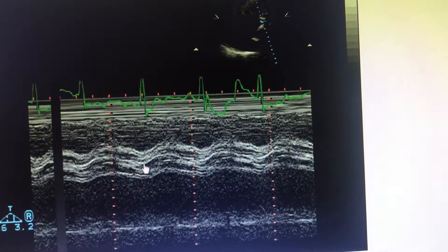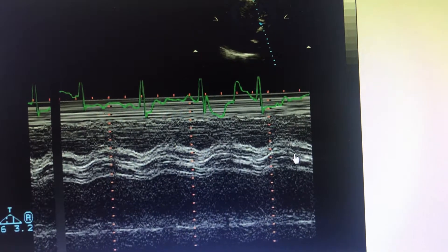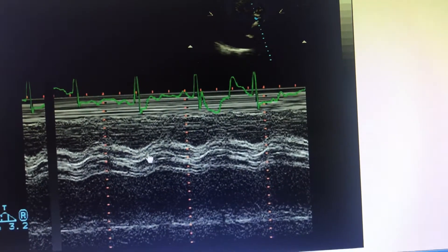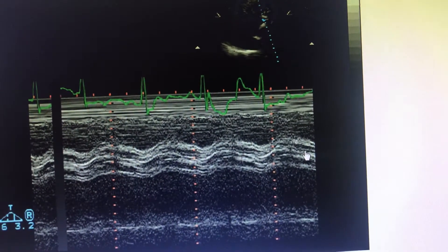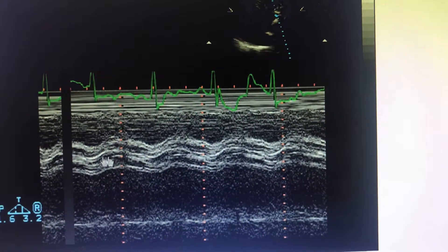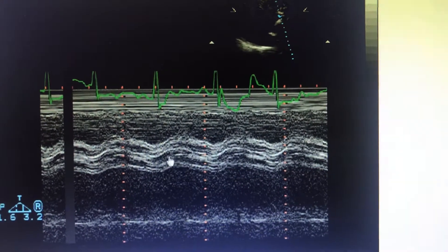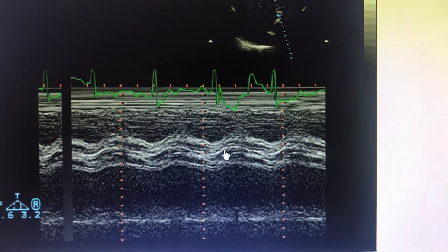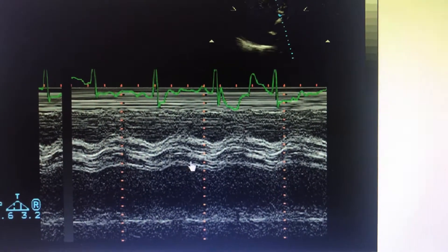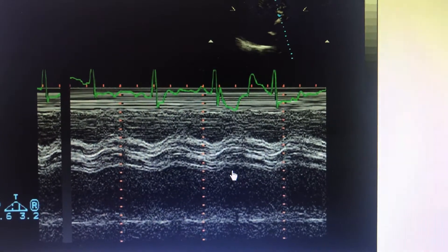What you can see here is that the aortic valve opens, but still there are two lines visible, and it closes and opens and closes, but there is still a marker — two lines which can be seen distinctly even after the M-Mode cursor passes through the opening. This is how aortic stenosis will appear in M-Mode. Because of the calcified aortic valve stenosis, it looks hyperdense or very much enhanced. If it is an eccentric aortic valve opening, it is more likely to be a bicuspid aortic valve disease.